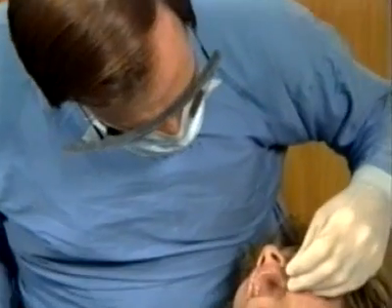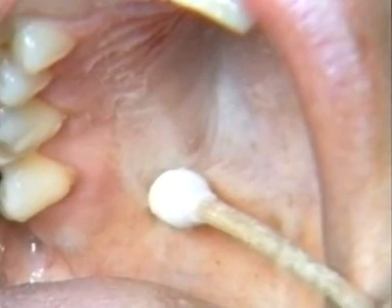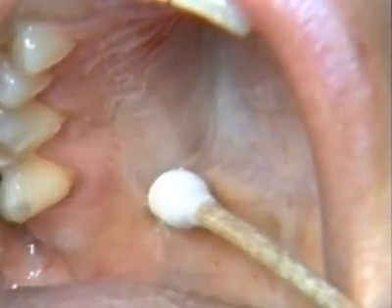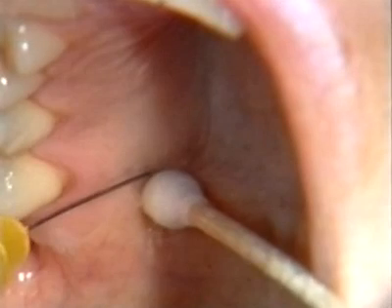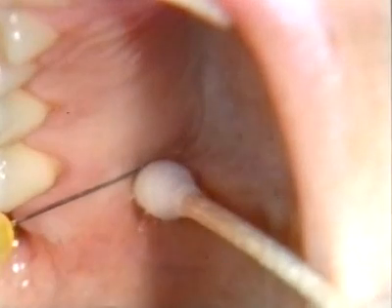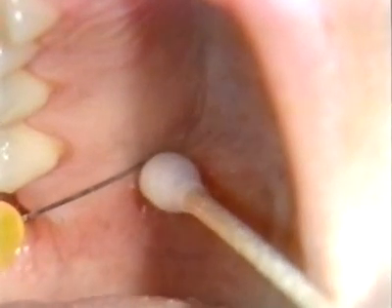Topical anesthesia of the hard palate is not easily achieved with conventional preparations. Additional analgesia may be obtained by applying pressure to the injection site with a cotton-tipped applicator. After about 20 seconds, the needle is inserted into the foramen as pressure is maintained and 0.1 to 0.2 milliliters of anesthetic solution is slowly deposited.